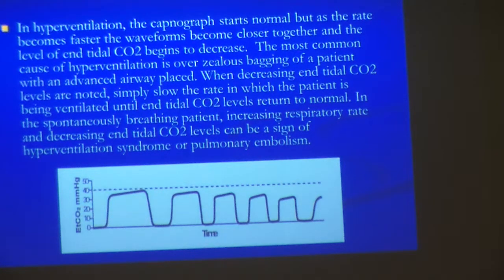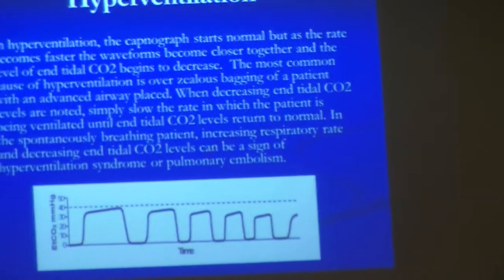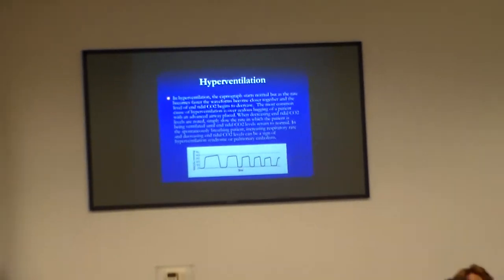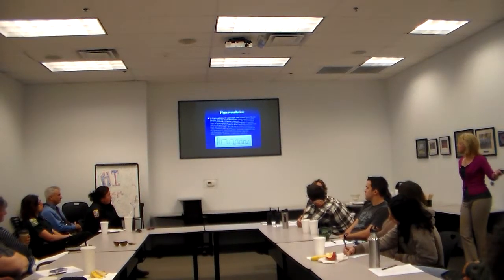The thing with end-tidal CO2 is you're not going to be able to diagnose your patient, but you can start going through in your mind what some possible causes of this issue might be. Are they just hyperventilating? If they're intubated, you're probably bagging them way too fast, so you just need to slow it down a little bit. And we've all done that. You get going and you're bagging the patient, and then you realize, oh, I don't have to bag it 30 times a minute.